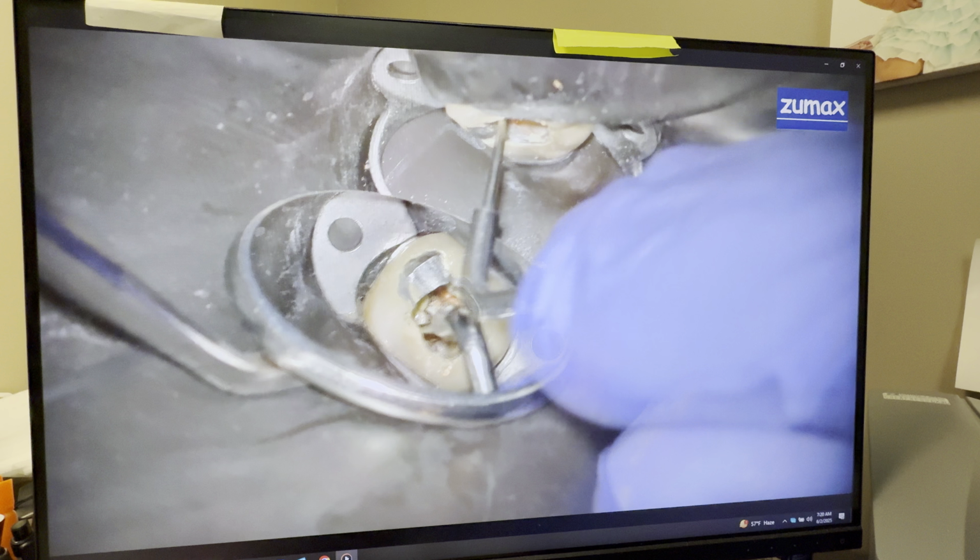All right. Remember, if you go 0.5 millimeter to 1 millimeter longer in such cases, it's okay. You're not damaging anything. Remember, there's periapical radiolucency there. So it's not like you're damaging the periapical area. All right, let's go ahead and measure the mesiolingual again now.